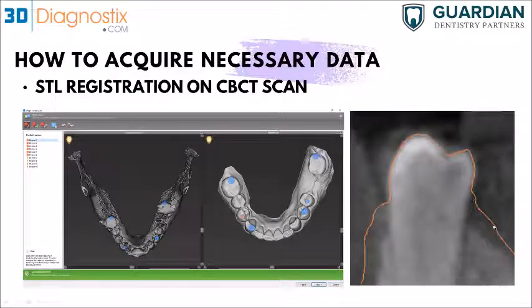You can see that this orange line is actually a cross-sectional cut in the impression. And you can also see the anatomy of the tooth right here in the scan. Since the patient was not scanned with the lips being separated, you can see that the shadow of the tissue is not really clear here. But as long as the tooth is clear and the scan does not have any artifacts or problems, we can just match the cusp tips, for example, together in the cross section.